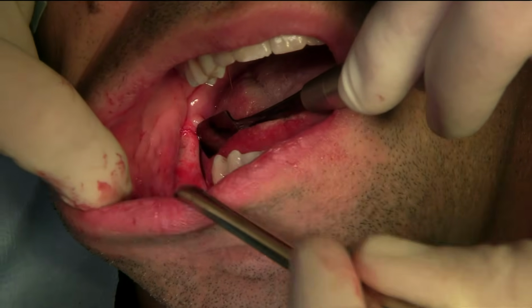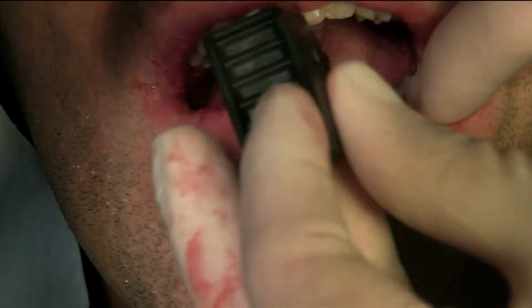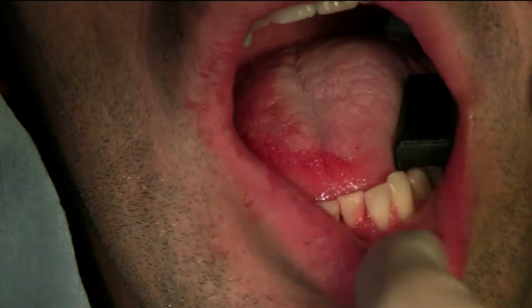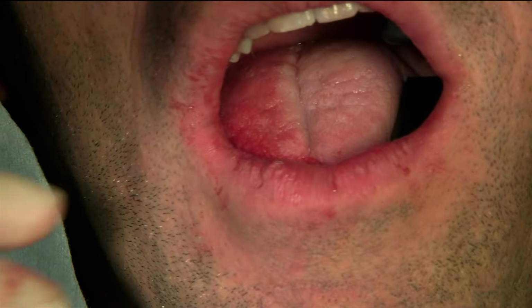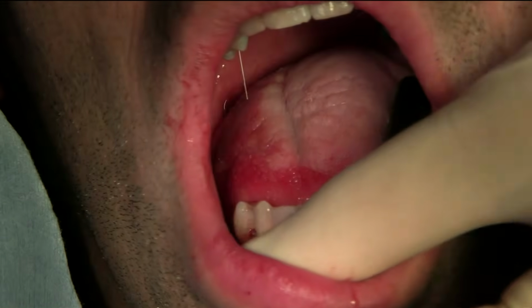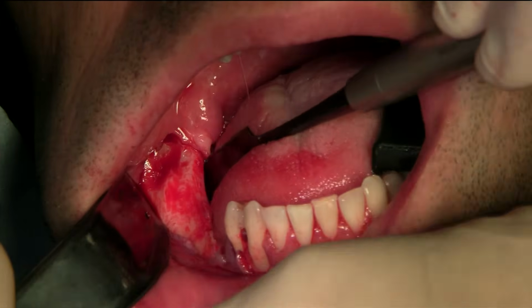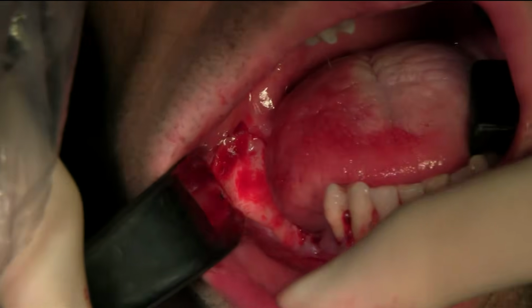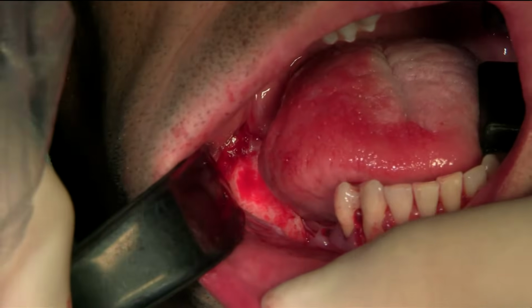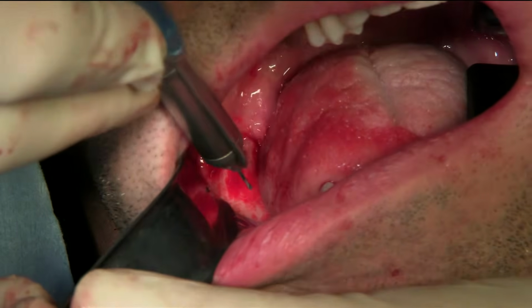So I need some. Can I put the bed block back in? Yeah. Open for me. Okay, retraction. What do you want me to use for keep retracting back here? Yeah, I need to go here. So maybe the anterior. Go a little bit left. A little bit left. Maddie, can I get a mirror? A mirror? And a Minnesota, please.